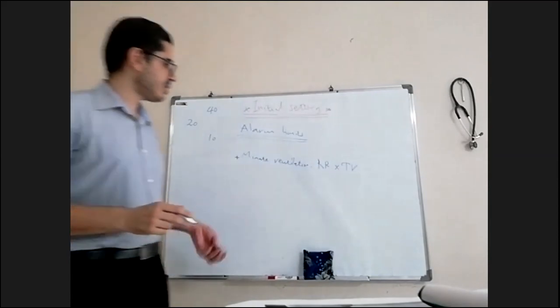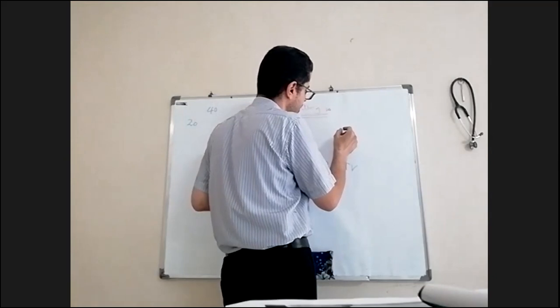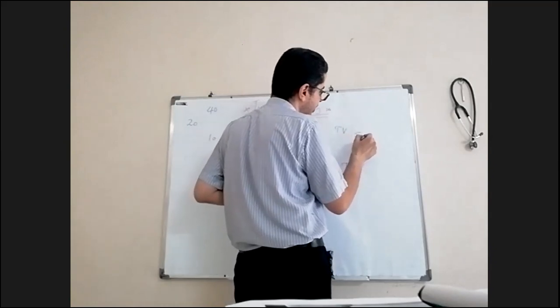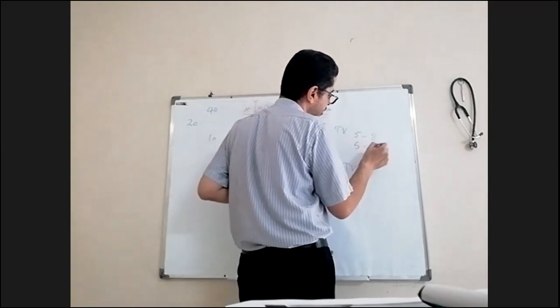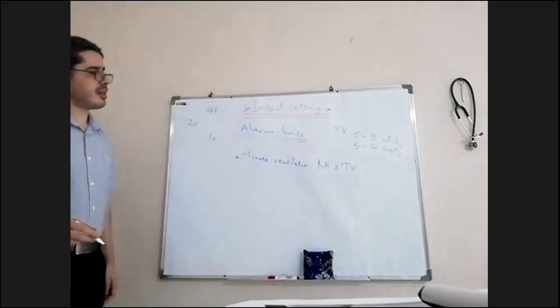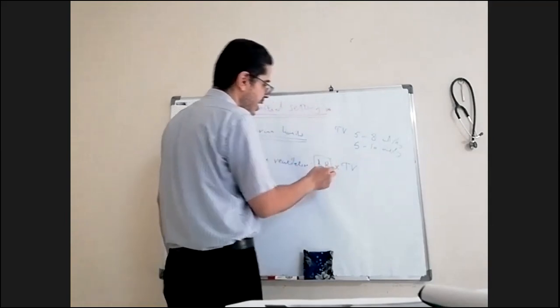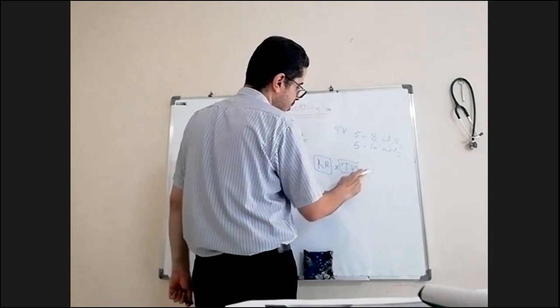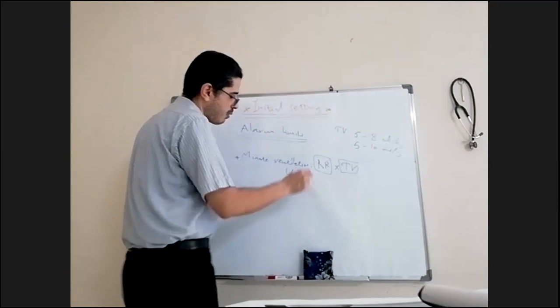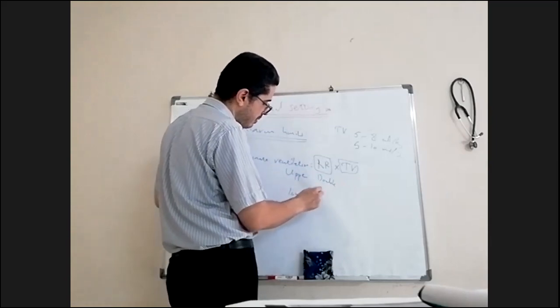So you see your patient, you see what is his normal tidal volume. For example, what is the normal tidal volume in children? So you can find some references 5 to 8, some others they tell you 5 to 10 ml per kg. That is the range of the tidal volume. So you take the normal RR for the patient and the normal tidal volume and multiply them. You see the result, and then the upper limit again will be double and the lower will be half.